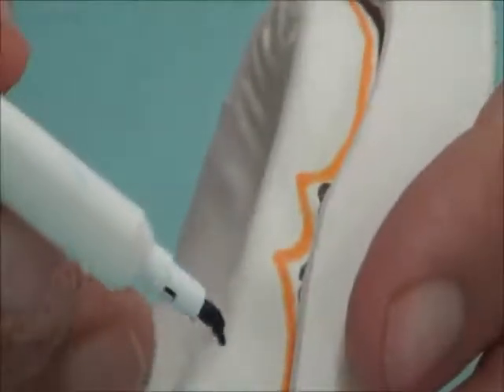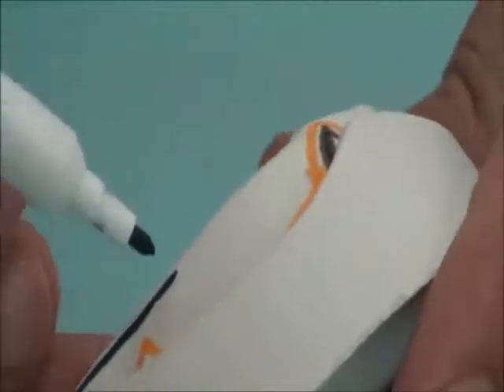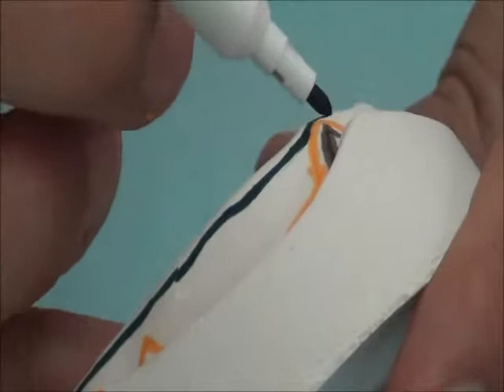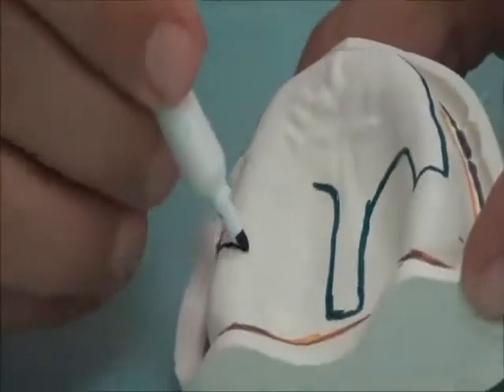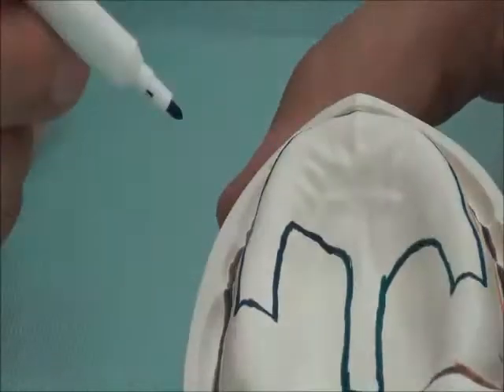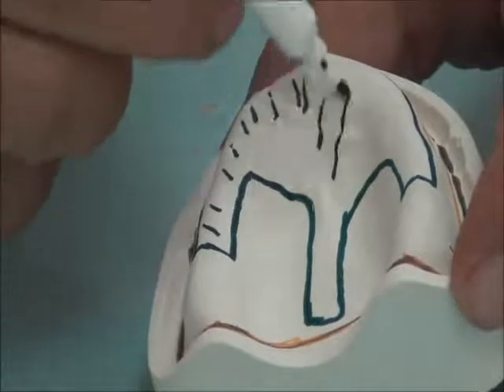The crest of the ridge, so it's over and away from the tray border. So the crest of the ridge, the incisive area, the rugae area are included inside these lines. We go all the way to the other side, exclude the tuberosity, and this is our relief area.